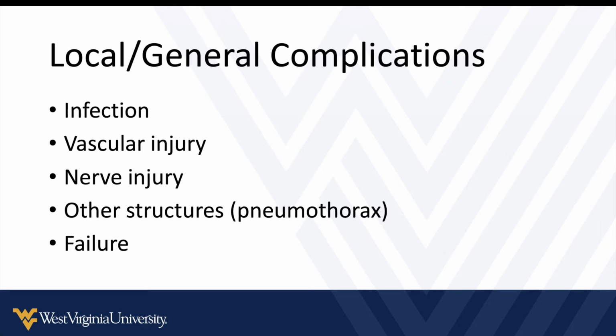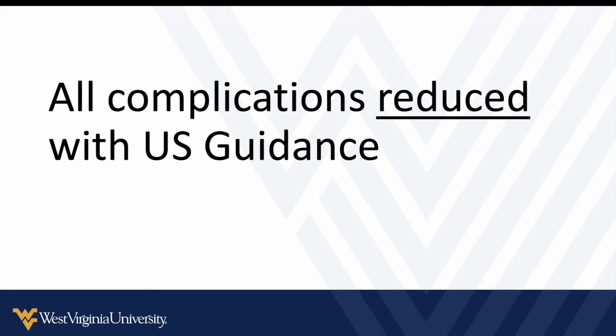These are all very low. The incidence of any of these things is pretty low, but they still exist. They're not zero, so we have to be aware of them, and we have to use strategies to mitigate some of these risks. All these complications are reduced because we're using ultrasound guidance, but they are not zero, you can't neglect them, and they have to be part of your informed consent process.